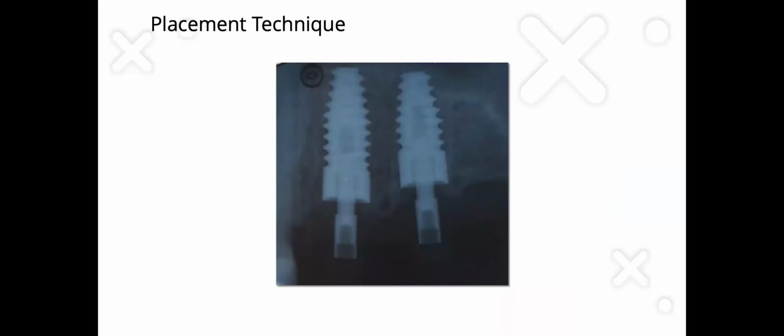Here we have the bone level implants with the smart peg, and we have 68 as the reading, and we can place a temporary on there right now. The Penguin, sorry, actually as well uses a smart peg to be able to detect the ISQ reading. But it's one piece, it's very user friendly, and it's cordless.